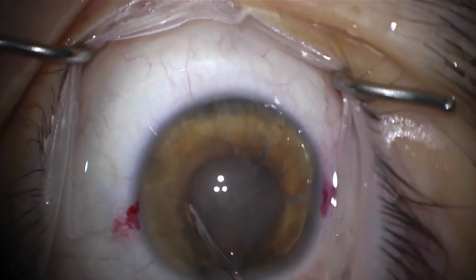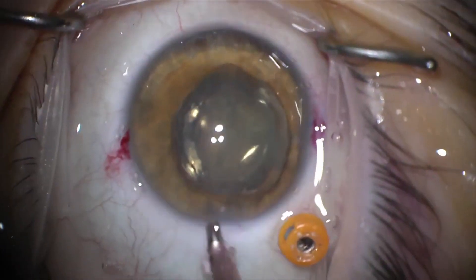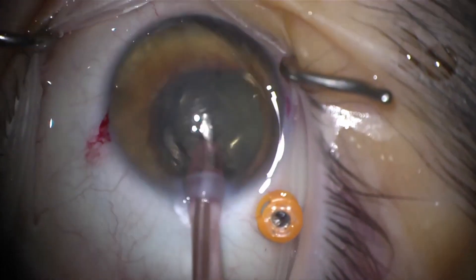Hydrodissection is then carried out. Dropping the heel and lifting the tip opens the wound and helps to prolapse the lens distally. The cataract is very soft and can be removed easily with a single-handed technique.